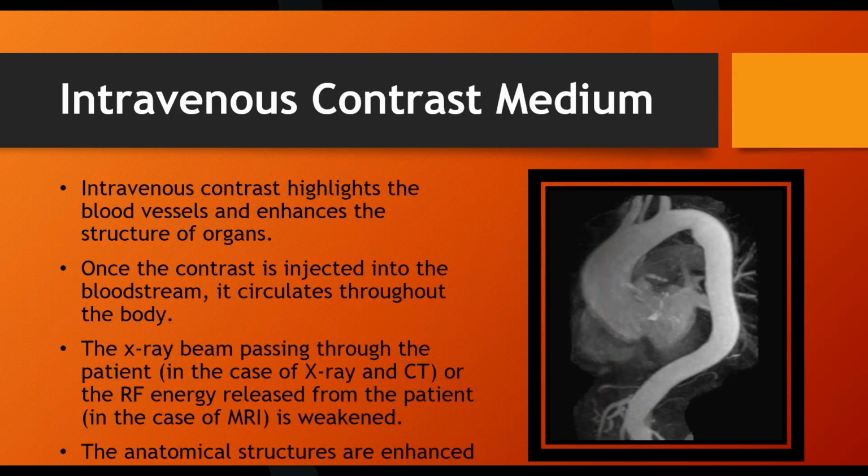Now, the reason that's important when it comes to the fluids, all right, so this is my syringe that this fluid goes into. I'll go into more detail about this later.